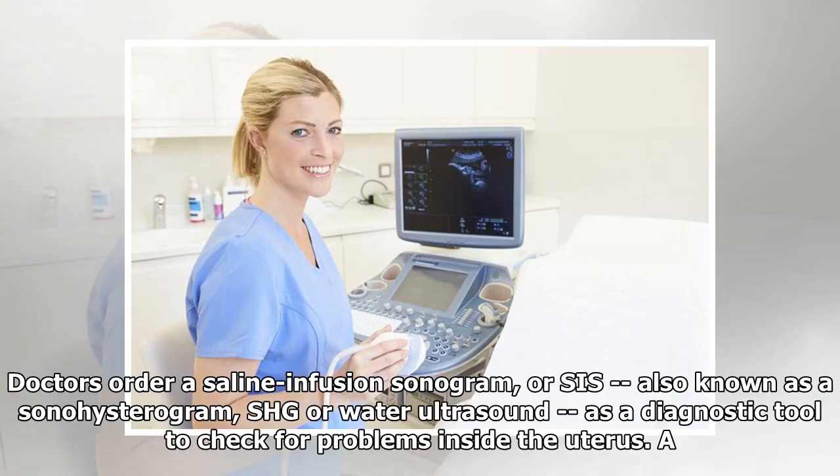Doctors order a saline infusion sonogram, or SIS, also known as a sonohysterogram, SHG or water ultrasound, as a diagnostic tool to check for problems inside the uterus.